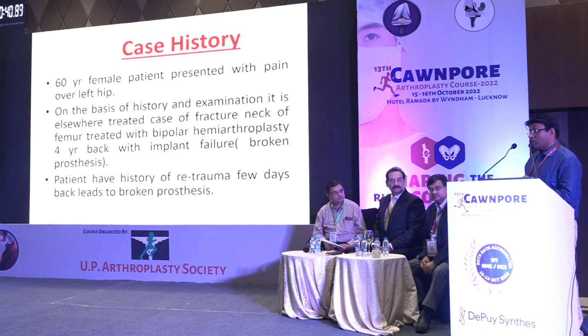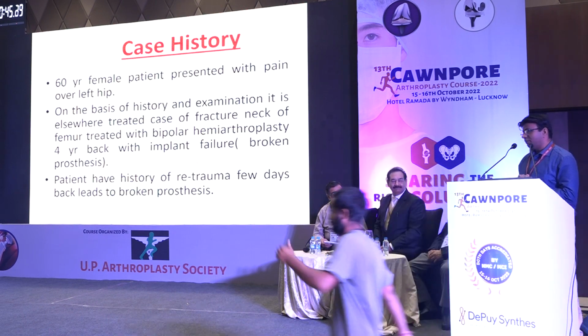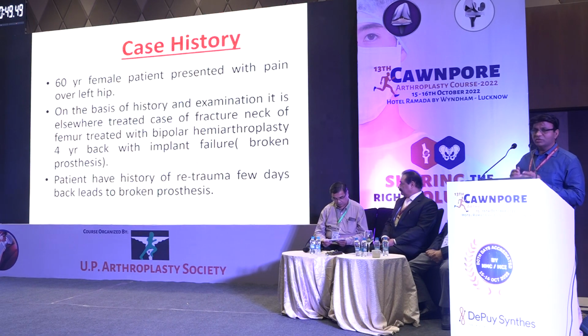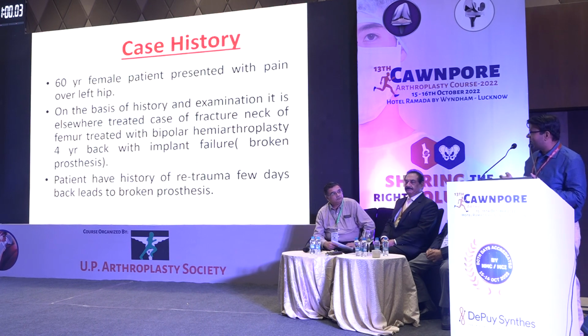I would suggest to all my young juniors that when you go through these cases, always make up your mind, and don't stick to one plan, A, B, C. We have to be very careful. Rajiv has covered almost all the things: allograft, autograft. In severe osteoporotic cases, I have used fibula also for the lateral wall when there is a perforation.